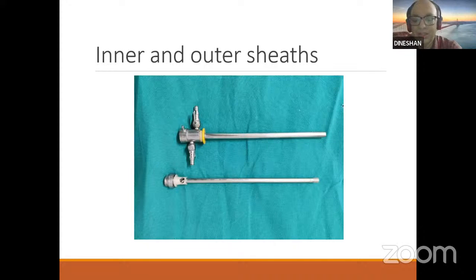It should not be blocked. Otherwise, if the outflow is partially blocked, the intravesical pressure will rise, and you can land into all sorts of problems. We will discuss that a little bit later. So that is where the cleaning of the instruments after the procedure and during the procedure comes. You have to always make sure that it is well cleaned, there are no clots after the procedure, and the outlet channel and the tip of the sheath are perfectly clean, devoid of all clots.